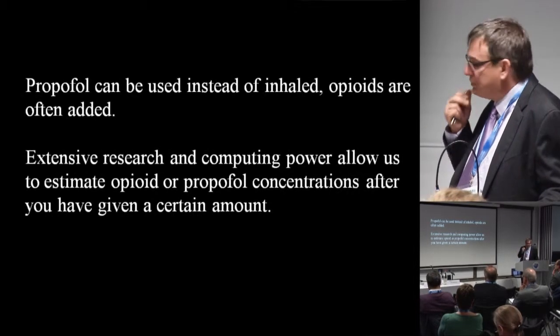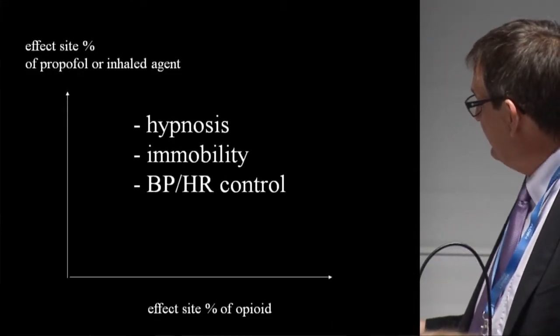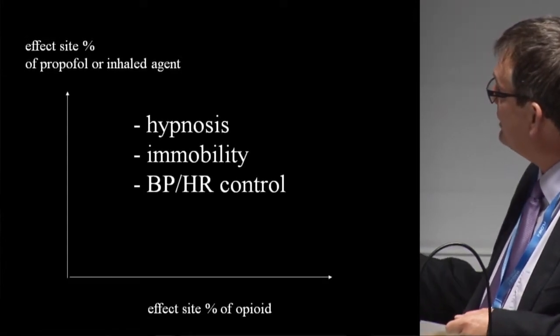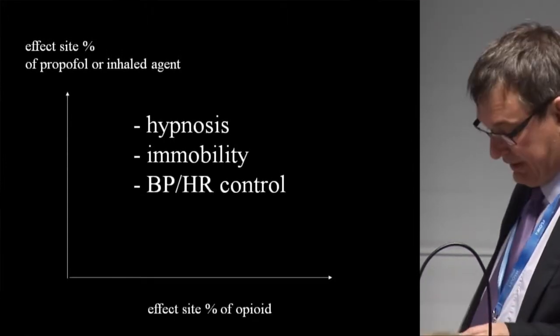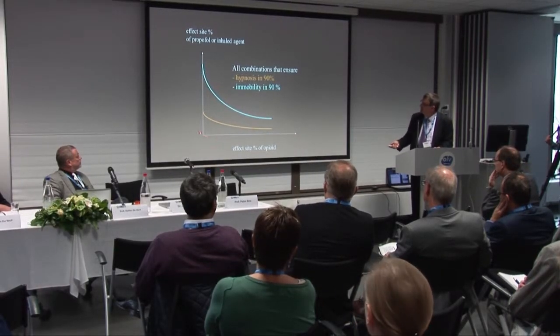Extensive research and computing power now allows us to estimate opioid and propofol concentrations after you have given a certain amount of the drug. We can actually estimate the concentration of the opioid. We can estimate the propofol concentration. Obviously, we measure the end-tidal, and we use a combination of these drugs to attain these clinical goals. And we can do this with different concentrations of both drugs, which we combine.